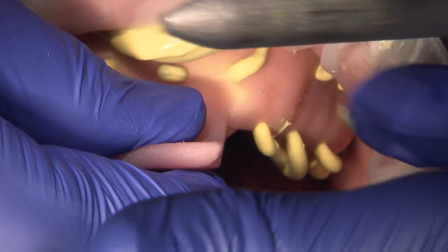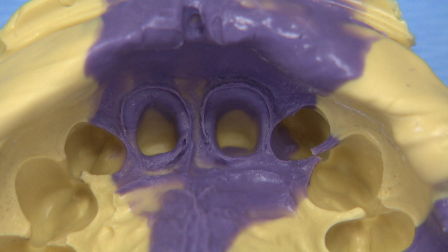Once everything is set up, we evaluate the set impression, and we hope to see material actually go beyond the margins of our prep. You can see there's a slight bubble on the mesiolingual aspect of number 9, but fortunately that was down in the sulcus and not on the actual margins of the tooth.